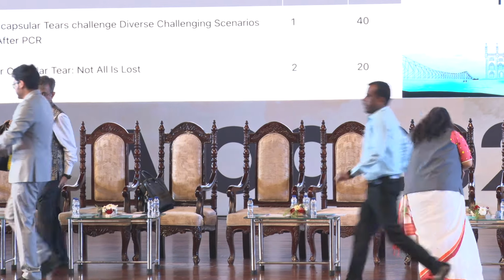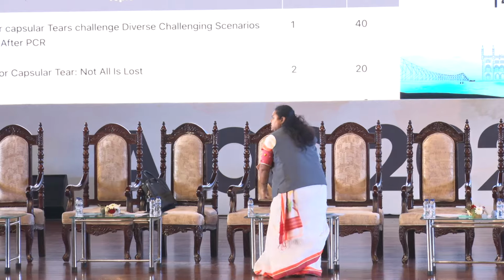IC is going to be on tackling capsular tears head-on video Odyssey.